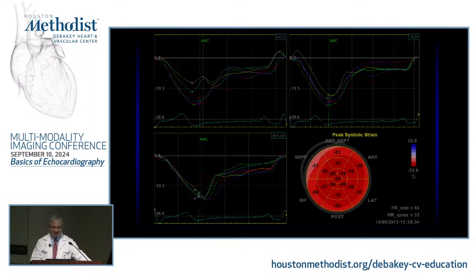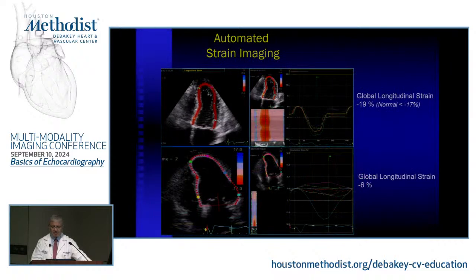Okay? So numbers, what are the numbers? Usually above 17, they're negative because in longitudinal strain, the heart is shrinking, right? For my purposes, we've written an editorial to take away the negative portion, but irrespective, whichever way you want to use it, as long as you use it intelligently. Above 18 or so is nice. The highest I've seen was about 34.